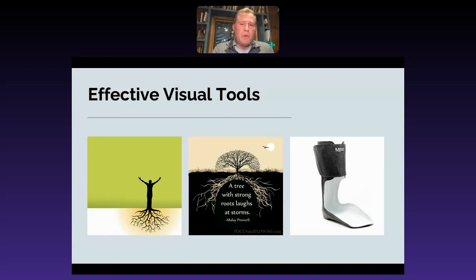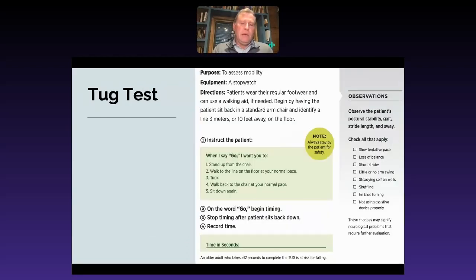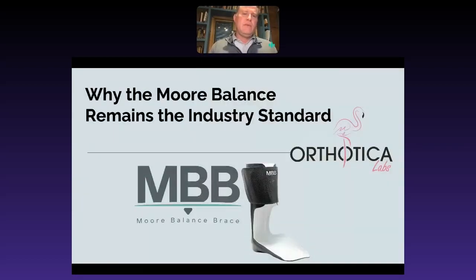So what are we doing with an AFO? This is the way I explain it to patients. We are basically enhancing your root system. What is it that keeps a tree up when a storm comes? It's your roots. And so by wearing these devices, which are lightweight, flexible, we are basically enhancing your root system. And that's what we do. This is, again, just a highlight here. We'll talk about this in a future talk, but we do the tug test. There's lots of really cool ways in which we do assessments in the office.